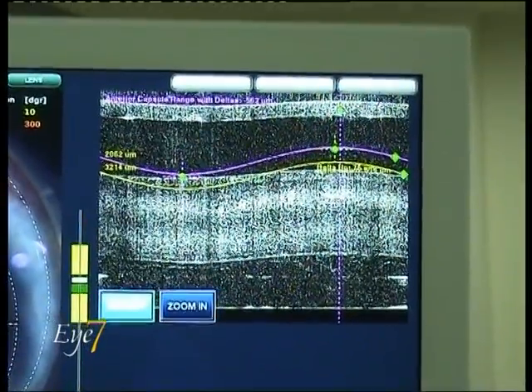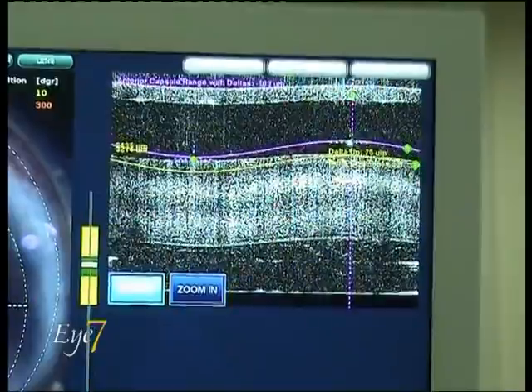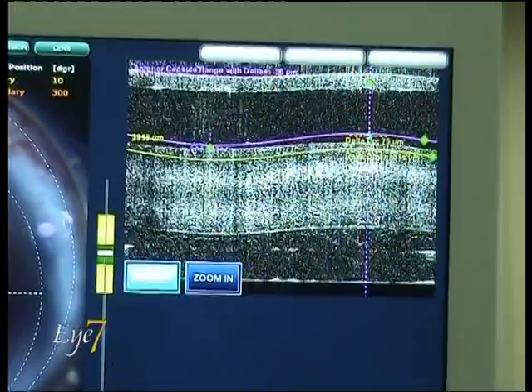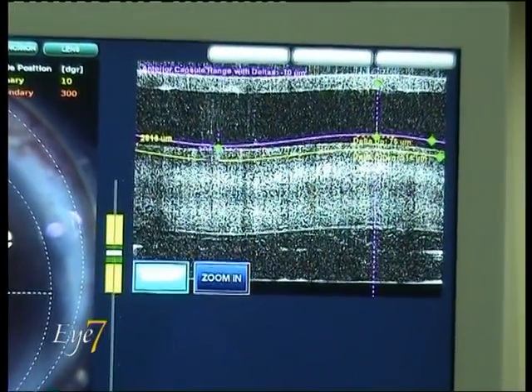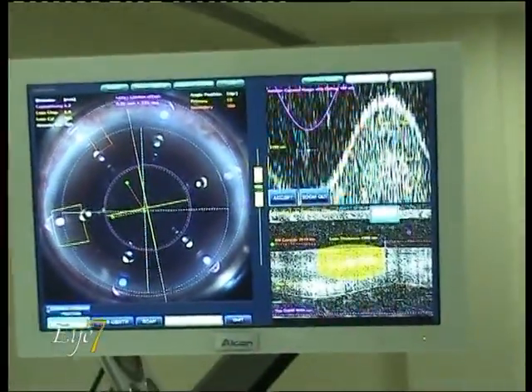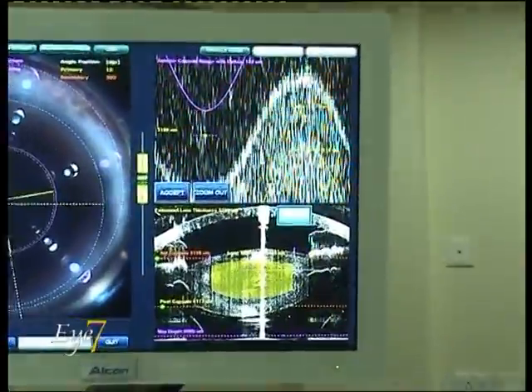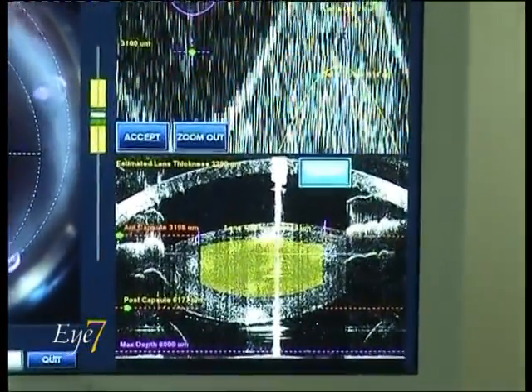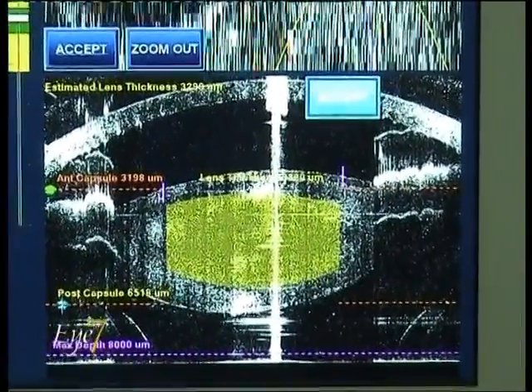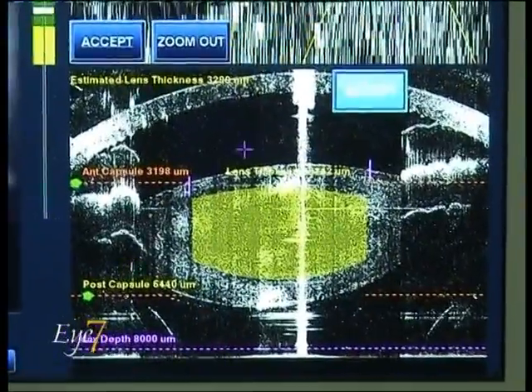There are two lines which you see here — the purple line and the yellow line — and the laser will cut between these two lines, so we place them in such a position that they are in front and back of the anterior capsule. We accept the data and move to the nucleus. We have to cut the nucleus as deep as possible, but we must maintain at least 800 microns safety zone from the posterior capsule.